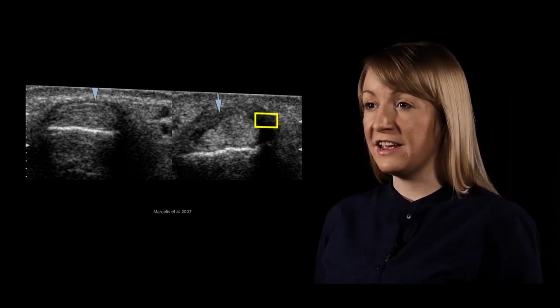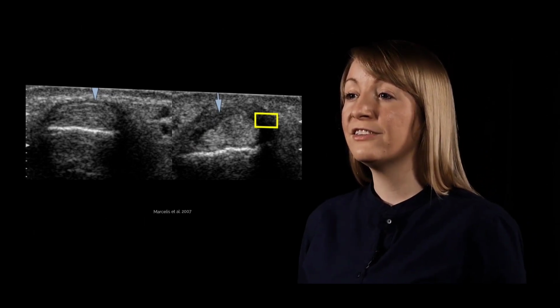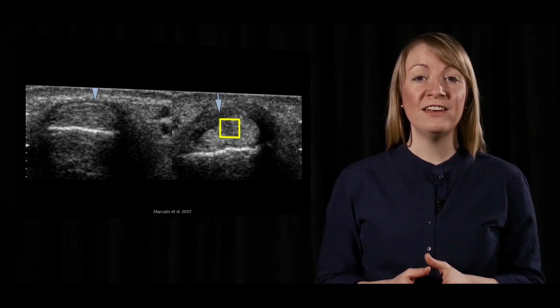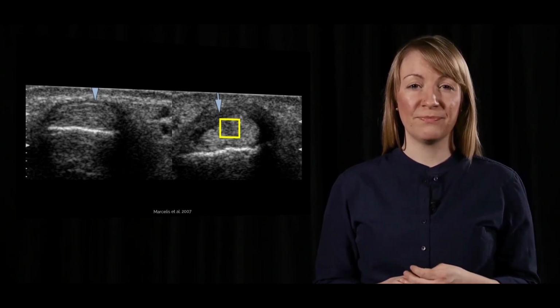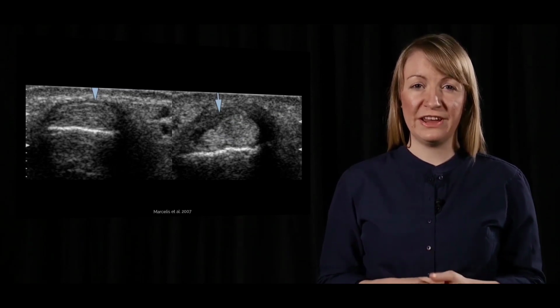The echogenicity of the retinaculum has changed. Due to the swelling, it has turned anechoic. The echogenicity of the tendon has also changed, a bit towards hypoechoic. There seems to be no problem in fibre continuity.